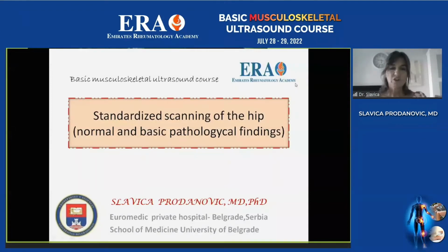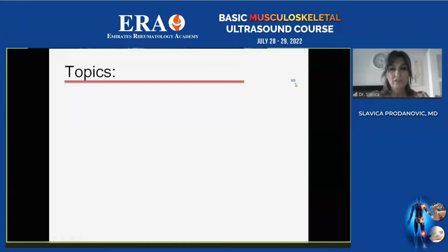The hip joint is a very important joint of our body, of course, like many others. This joint provides a wide range of motion that allows us everyday activities. The topics of my lecture will be anatomy, then ultrasound examination, and basic pathology of the hip joint.